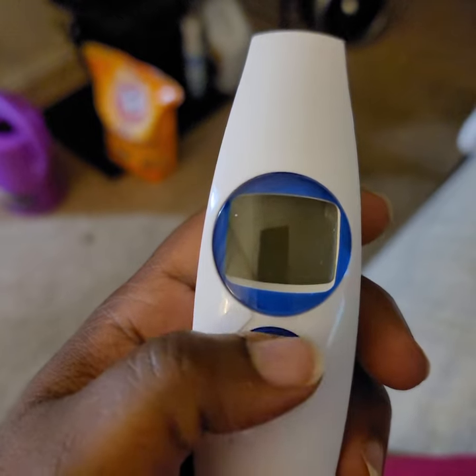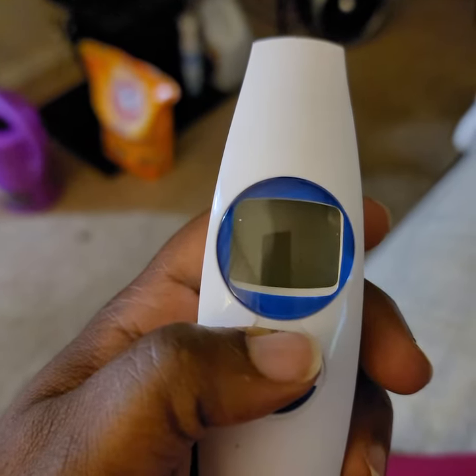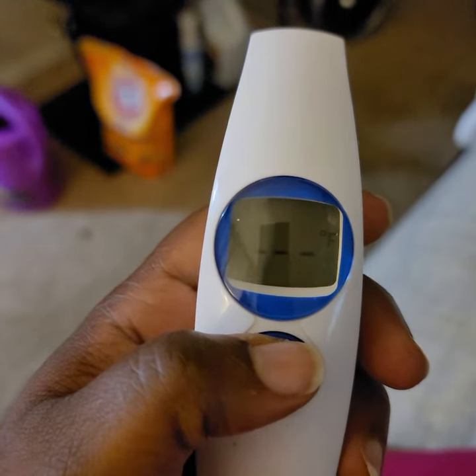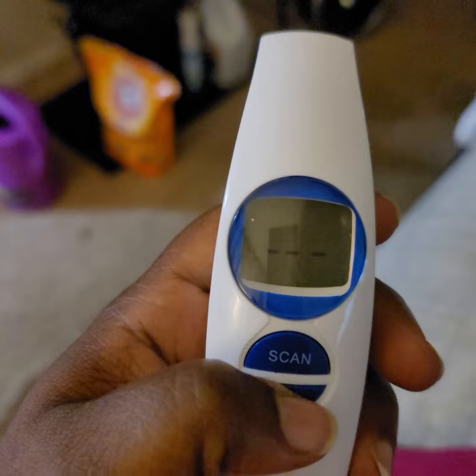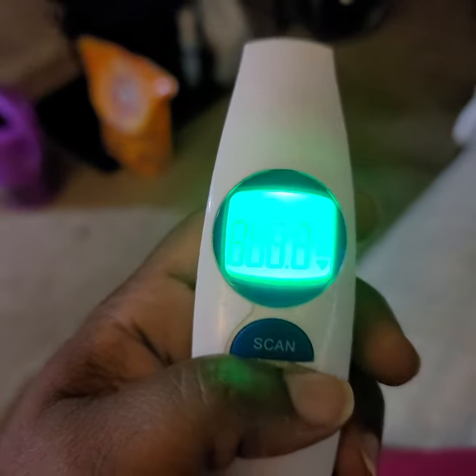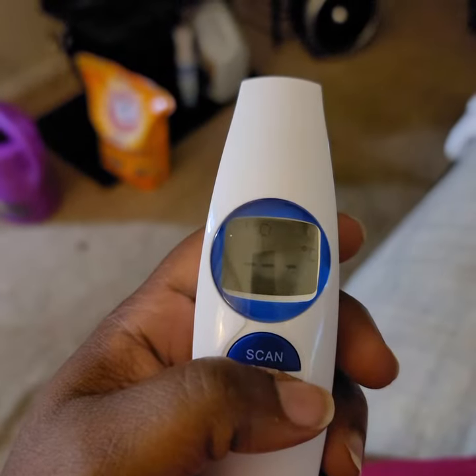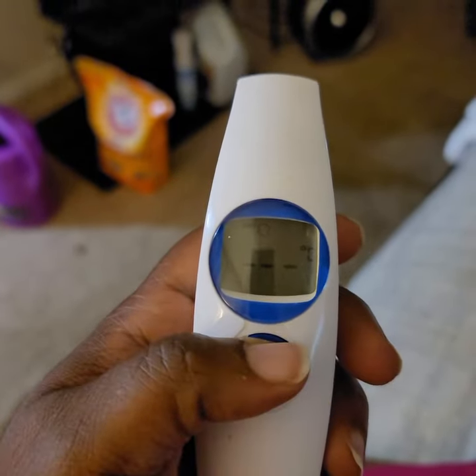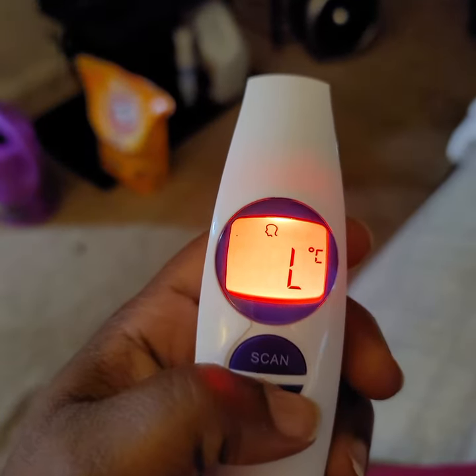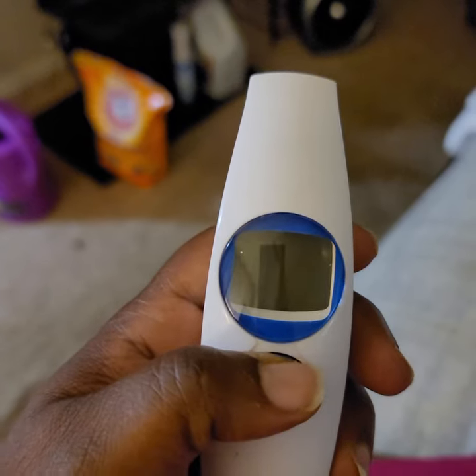We can change it back. Hold scan for five seconds — Fahrenheit, Celsius. Hit the power button. As you can see it's on Celsius. Hold the power and scan button to change it back.